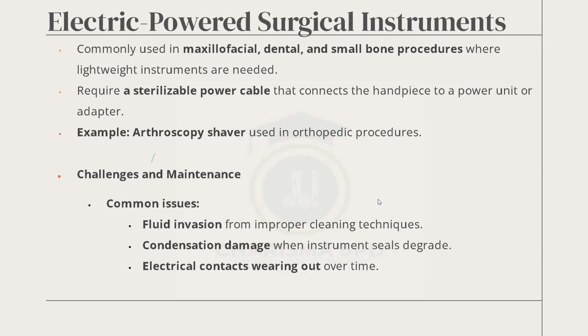Electric power. Commonly used in maxillofacial, dental, and small bone procedures. So maxillofacial, that is kind of in the skull, neuro and those things.